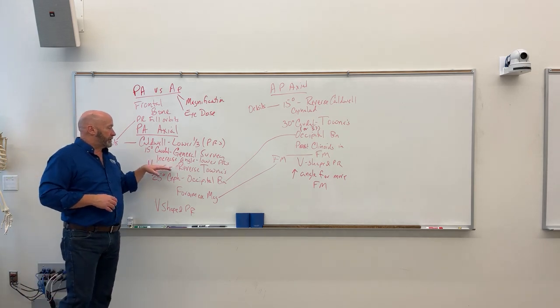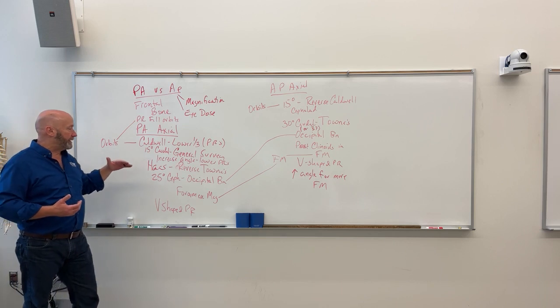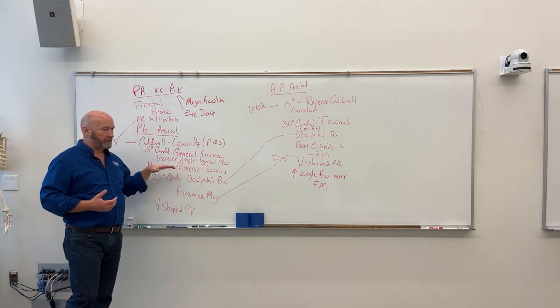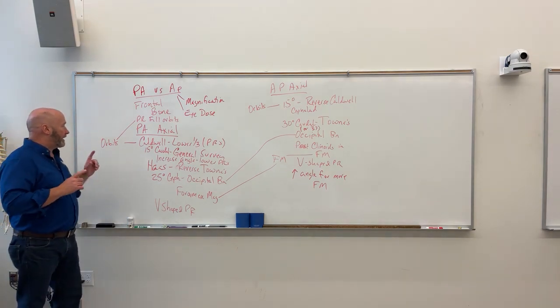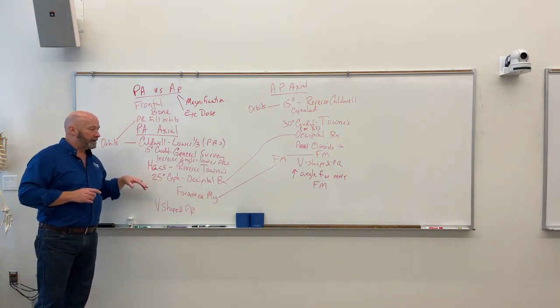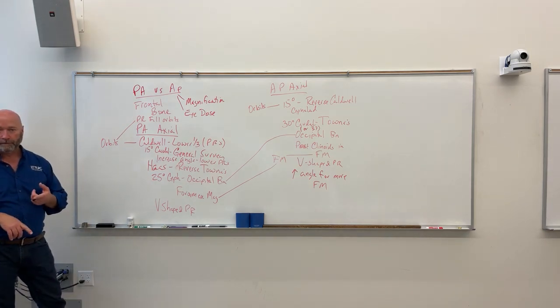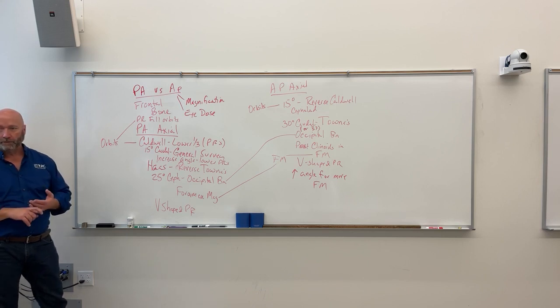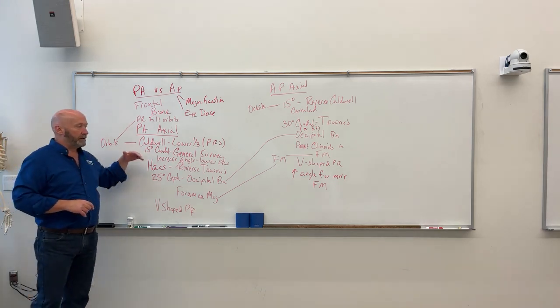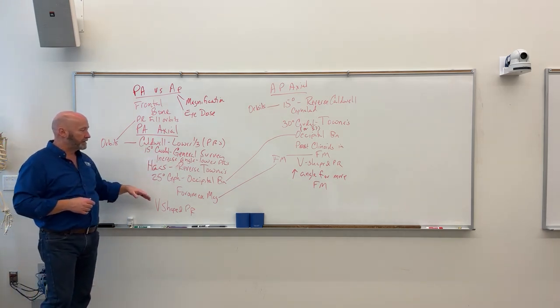So we're going to take a look at some images here in a minute. I think I might have mentioned it last Monday, but we'll talk about the angulation as we increase angulation, what we're going to get then. All right. But the other PA axial is going to be the Haas, and how you're going to tell the difference between them is what are you looking for, right? What the angulation is number-wise, and what the angulation is direction-wise. So the Caldwell is always going to be caudal. All right. So Caldwell caudal. And the Haas is going to be cephalic.